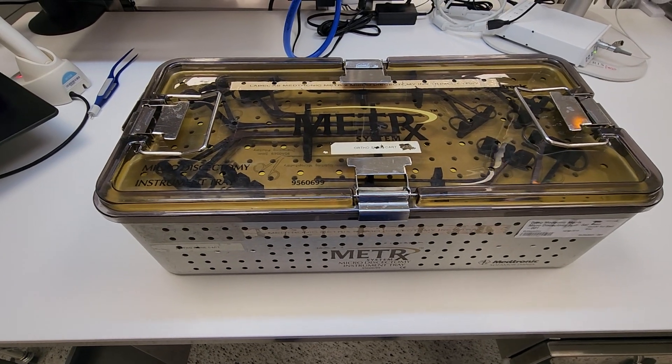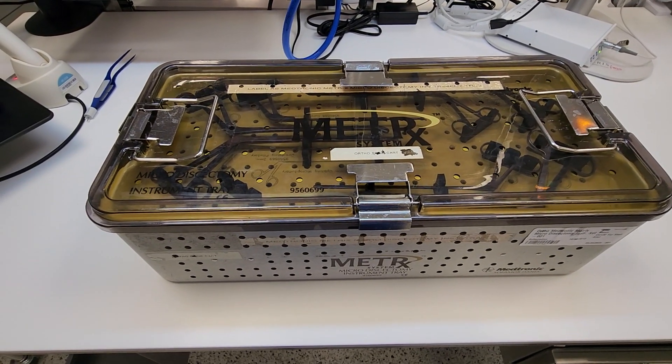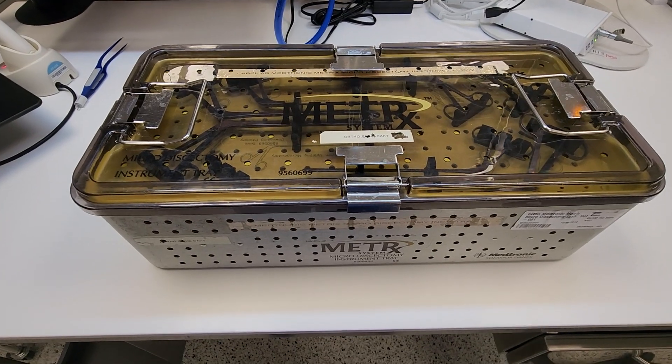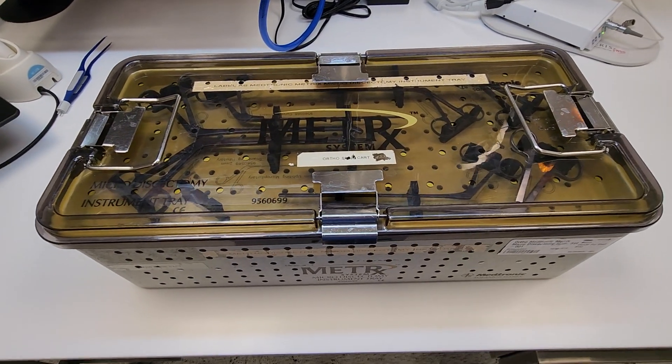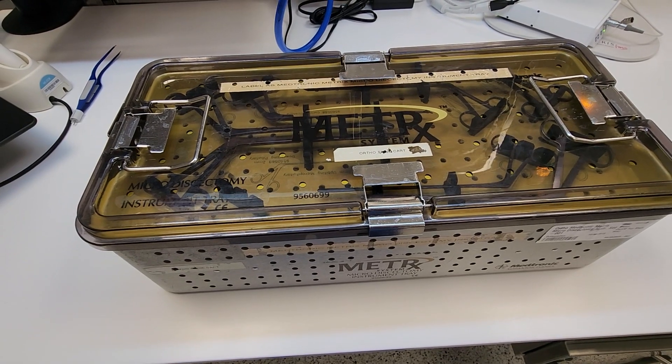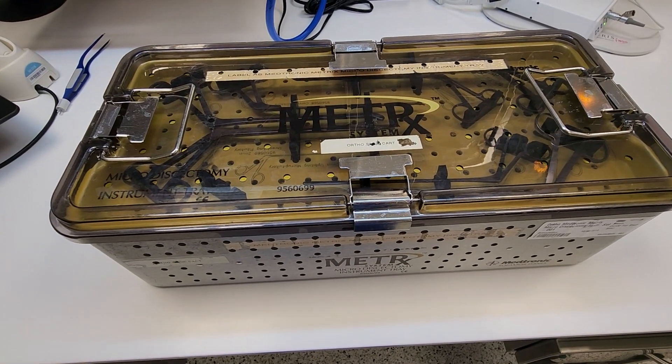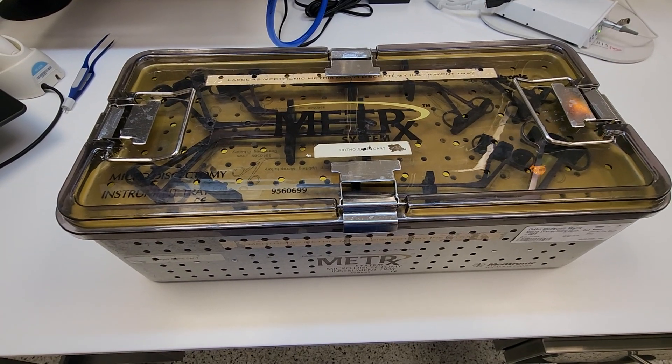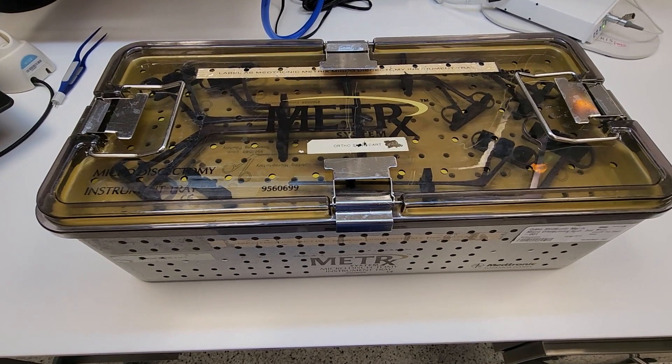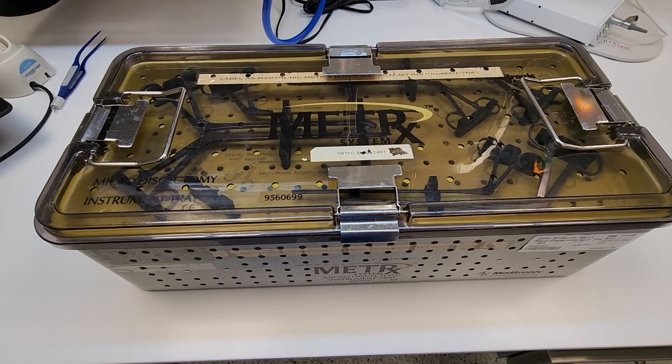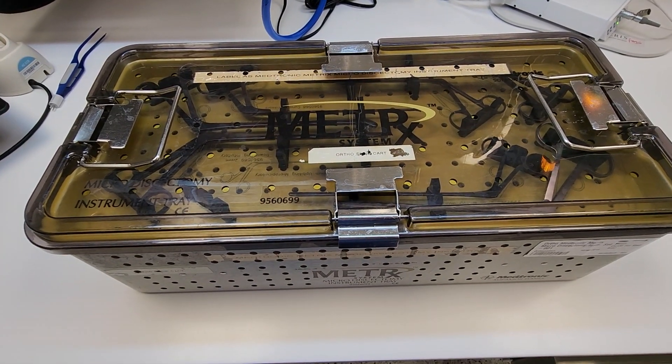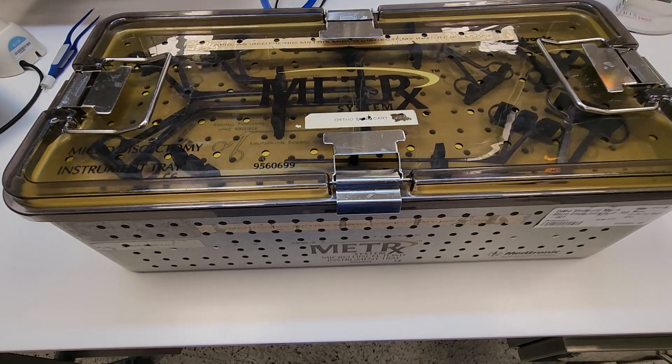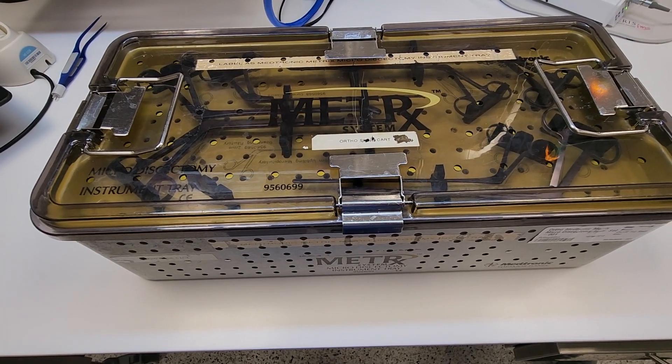All right guys, so we often talk about indicator placement within a tray, and you have to first determine what does the IFU of the indicator state and what are the best practices. Then you also have to determine is this tray going into a rigid container or is it going to be wrapped in SMS.